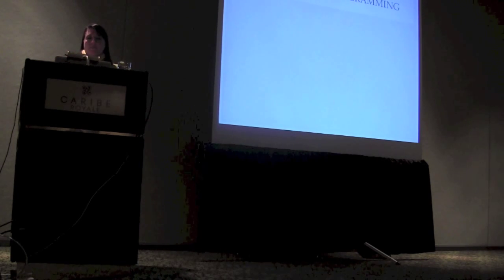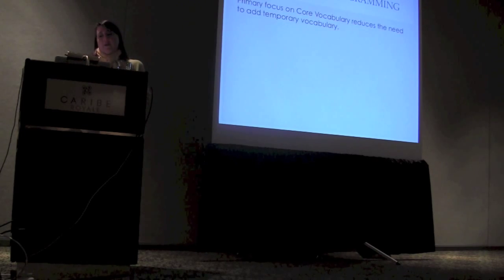The other thing I think that is really important that we talk about is that core vocabulary reduces programming time. How many of you guys spend hours programming vocabulary into your devices, especially in the school environment?